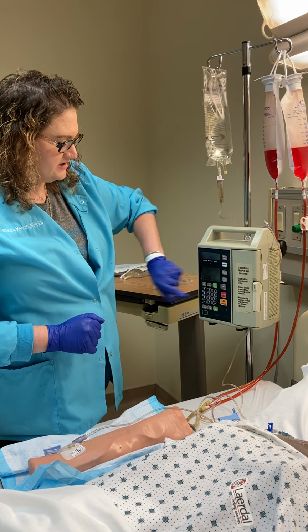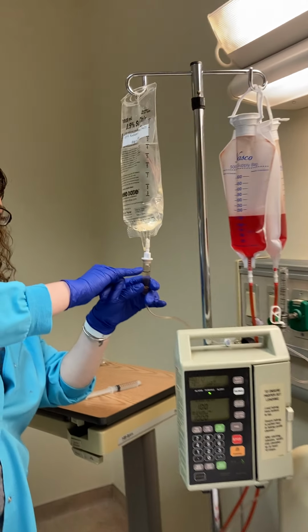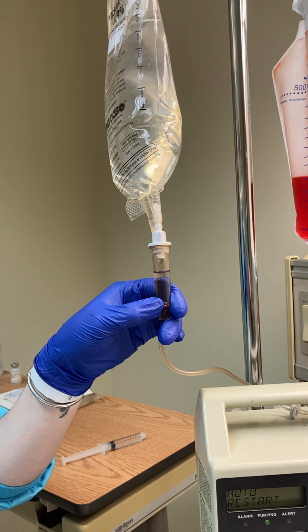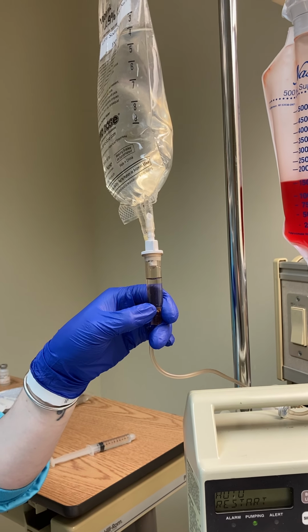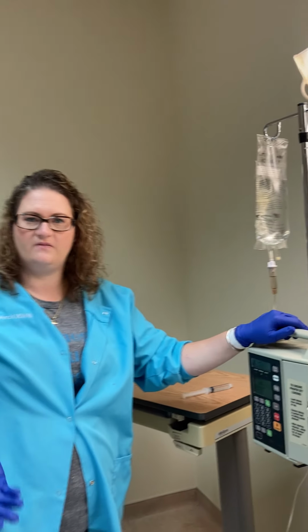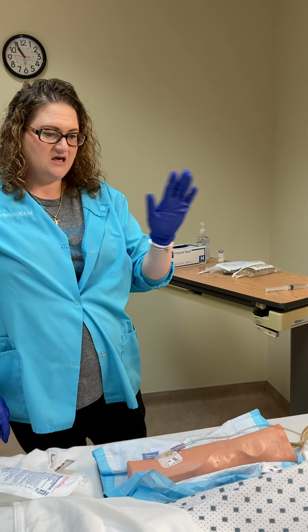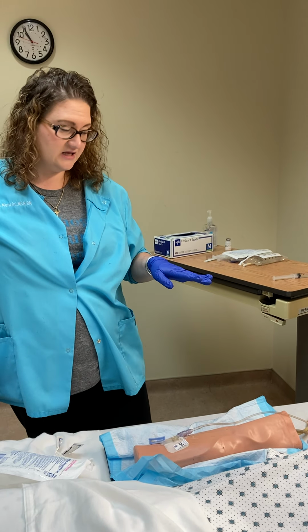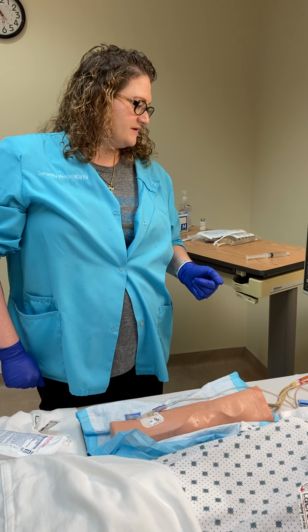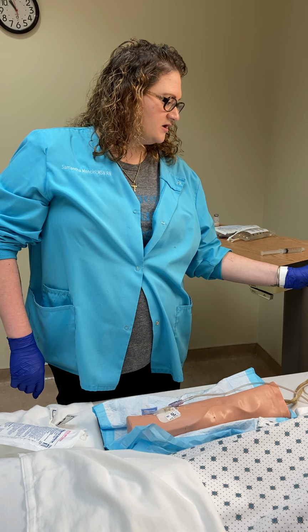And now I can hit primary start. And I should see drops coming in the chamber. So you always want to make sure you have drops before you leave the room. You assess throughout to make sure that the patient's not having any complaints of pain, watching for any signs of infiltration, phlebitis. He said he's good. He's tolerating it. This is normal saline that's running. And that's pretty much it as far as setting up a primary.